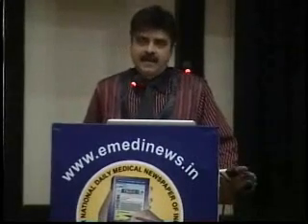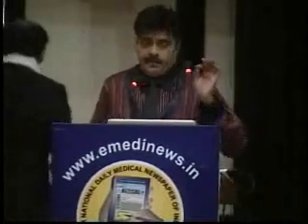The parathyroids: the imaging modality for a parathyroid adenoma that could produce primary hyperparathyroidism is an isotope scan. People refer for an MRI. Now, usually an MRI will not be able to pick up a parathyroid adenoma. An isotope scan can actually very easily pick up a parathyroid adenoma.